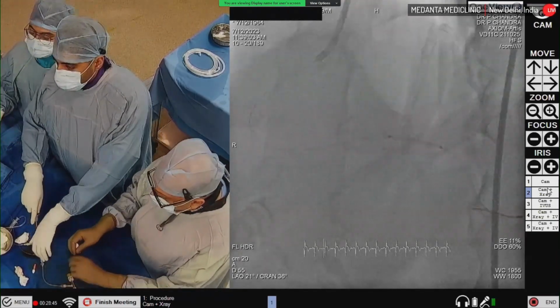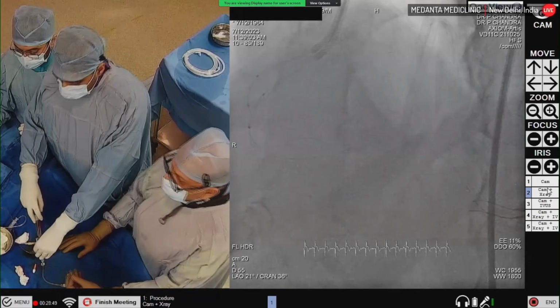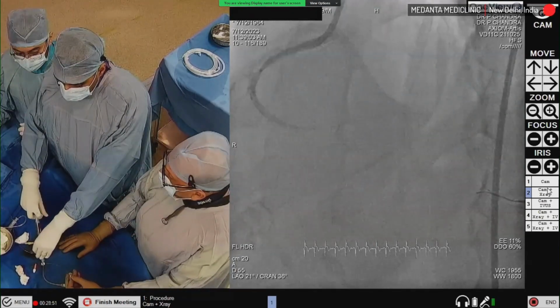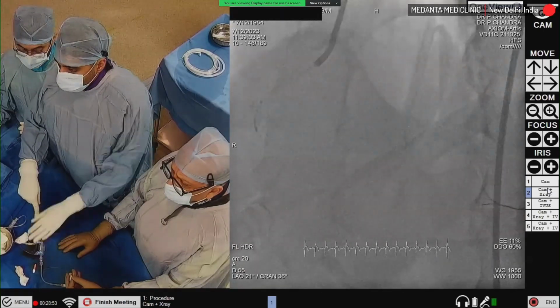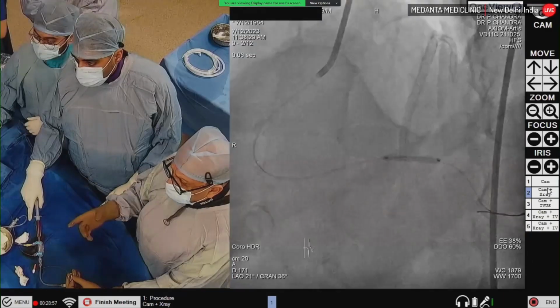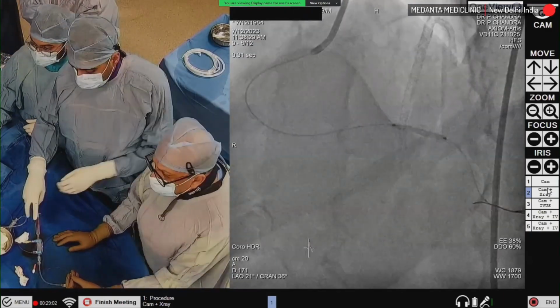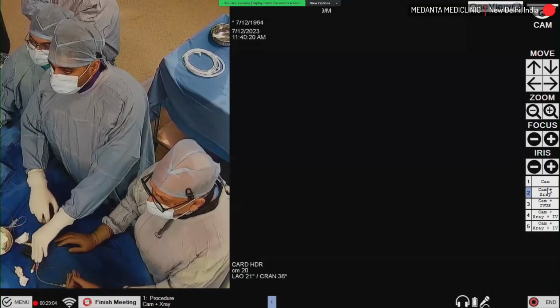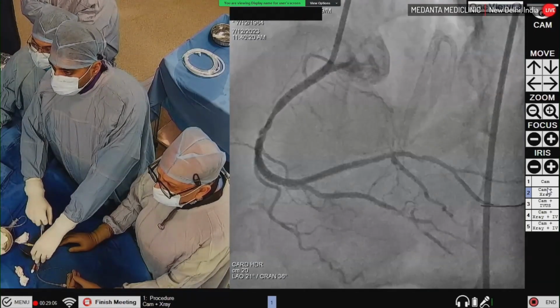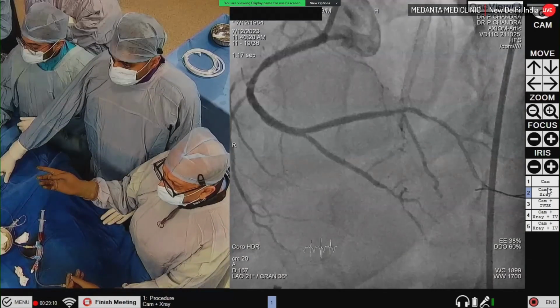And so now which drug-eluting balloon are we going to take? So typically, now since the sirolimus-eluting balloons are available, and we have now, show me the last one, the last shot. So should we take a 20 or a 25? That's the question. Take a shot, please. Shot. This looks very nice. I think 25 will be better. Give me a 25.